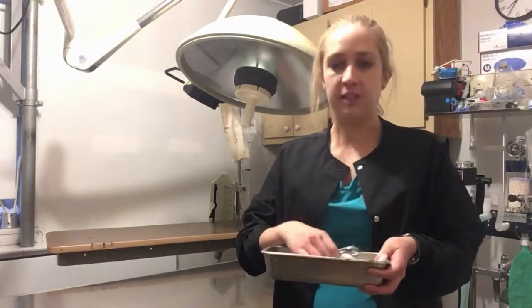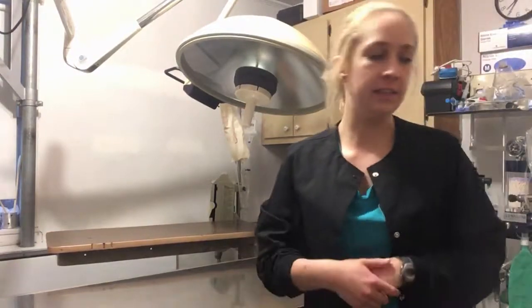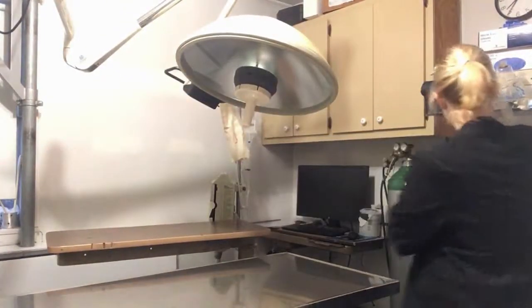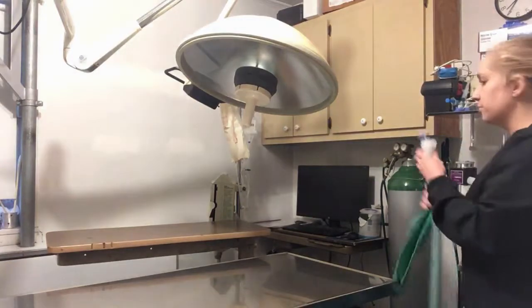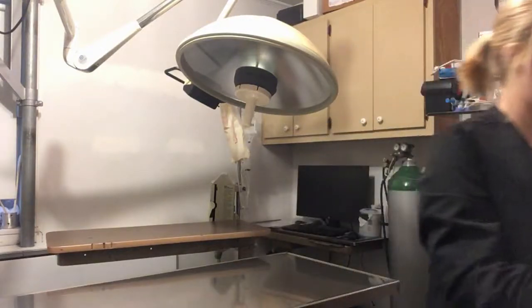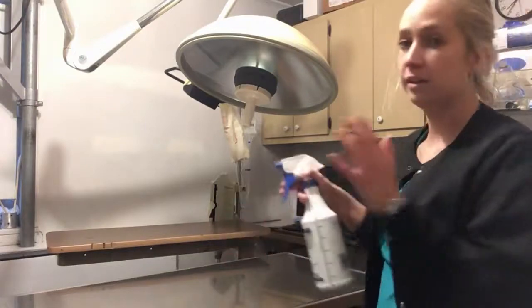After that, I will take my instruments over to where I'm going to clean them. Other than that, you want to remove all the things you used in your procedure, circuits, things like that, so that they can be replaced for the next patient. And then after that, you want to thoroughly clean the area.